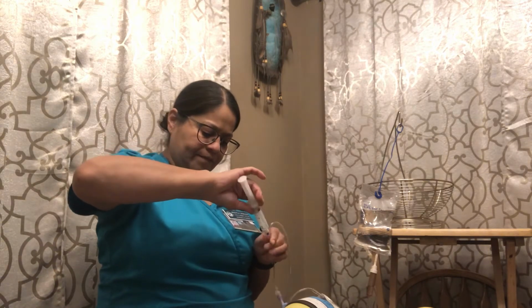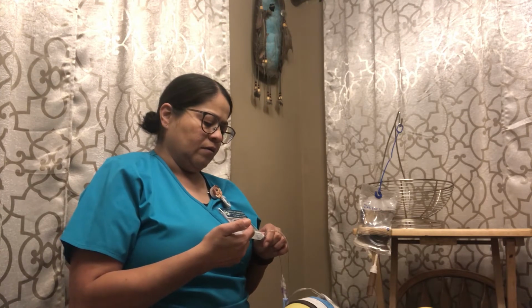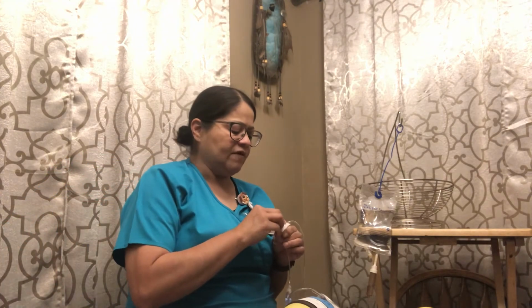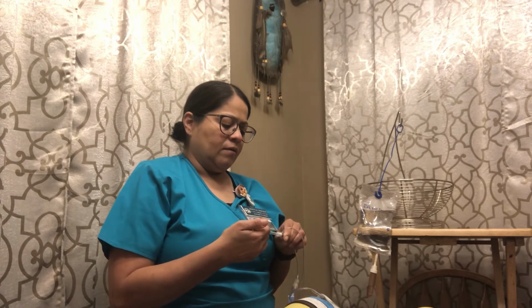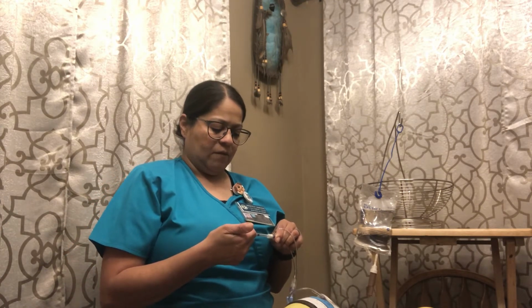I've taken my cap off my flush. Make sure a little bit of fluid comes out of the top. I'm going to go ahead and place that in my port. And I'm going to flush it with 4 mLs of normal saline. Okay, remove that. And then I'm going to clean my port again for 15 seconds. Let it dry. Now I have my medication ready to go. Make sure it's primed to the top. Put it in. And I'm going to inject slowly, 0.5 ml. And then I'm going to wait a minute. So the minute has passed. And then I'm going to inject the next 0.5 ml slowly.